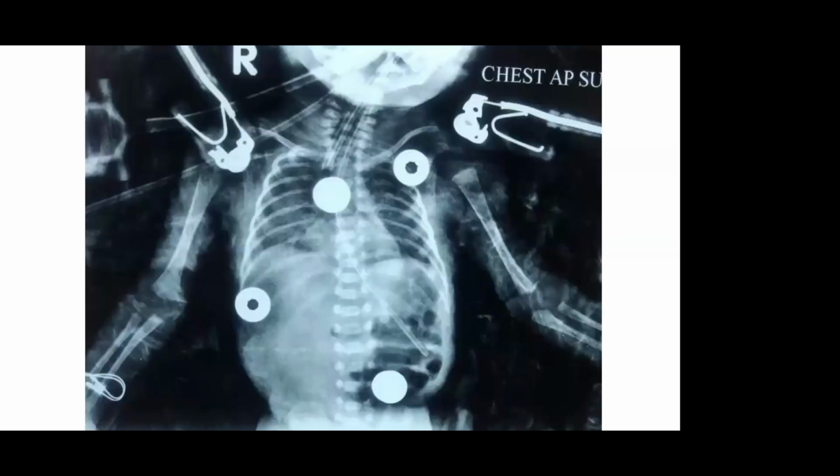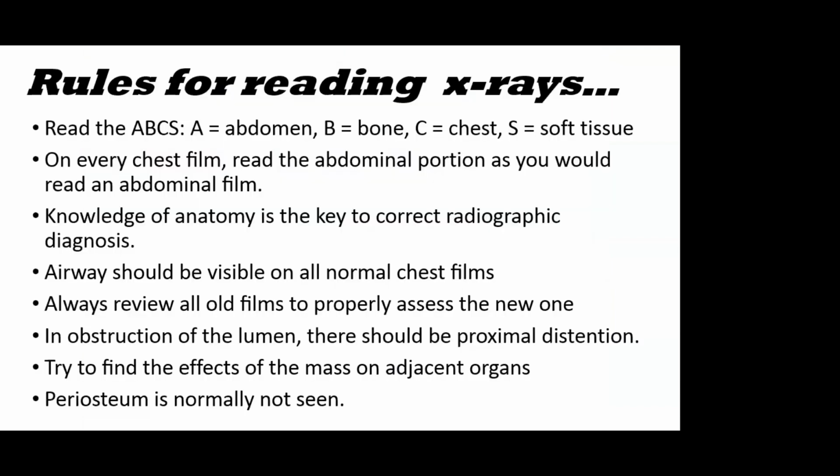When you are putting ECG leads, even though you remove the wires from the major area, if you are taking a total 12 lead ECG, see to it that those leads also need to be removed. While removing, see to it you don't create adhesive or skin injury, and simultaneously see to it that it is not obstructing the lung field also. So whatever is obstructing the lung field, try to keep it away from your area of interest.